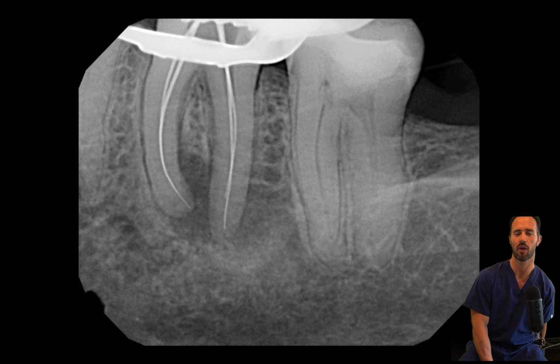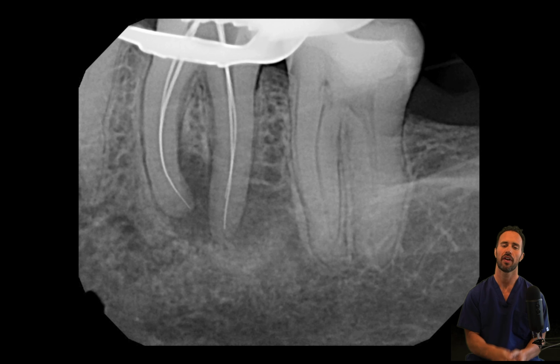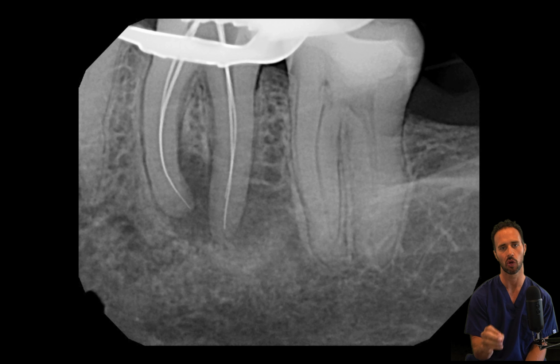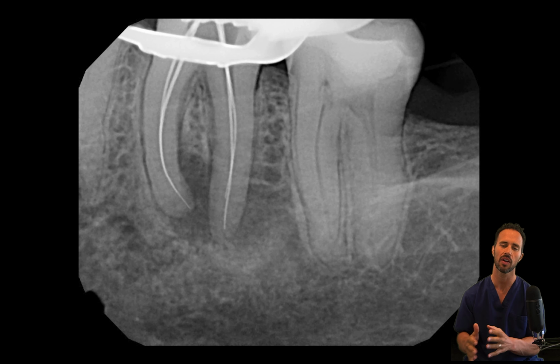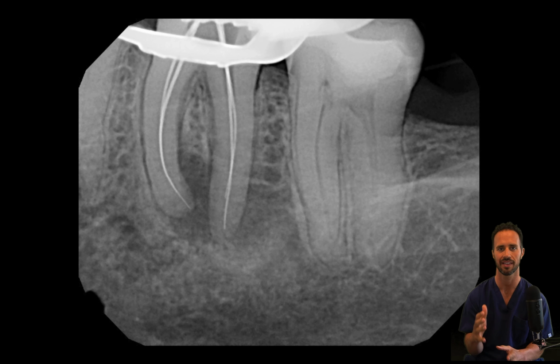We are here for our second visit of our 2-visit treatment on this lower molar, tooth number 19. This patient waited 2 weeks after her first visit, and now she's here for her obturation appointment after we've completely instrumented this case and placed calcium hydroxide.